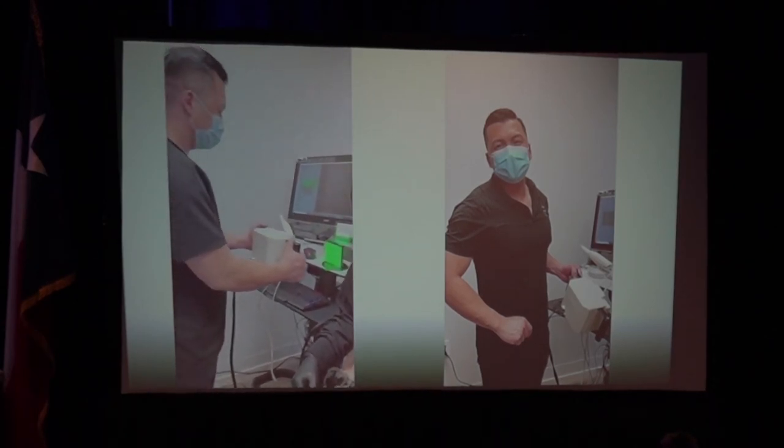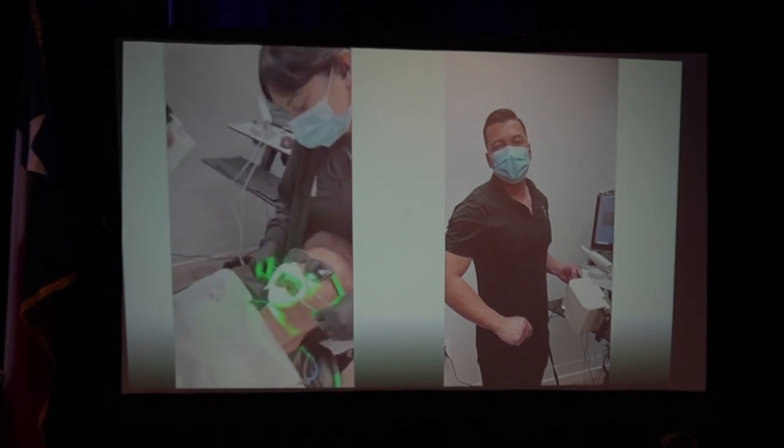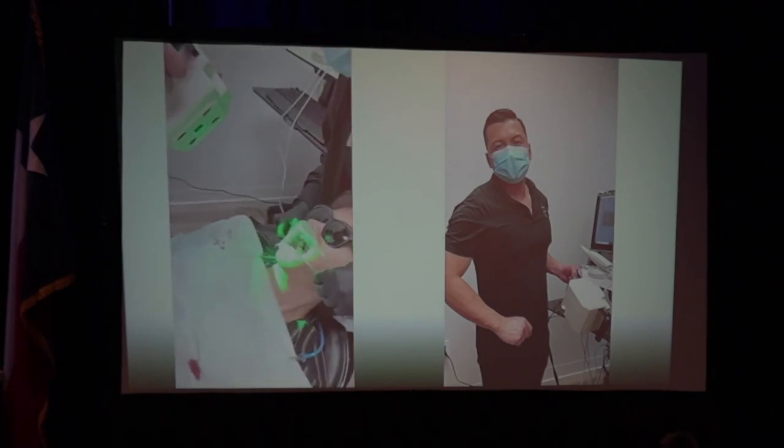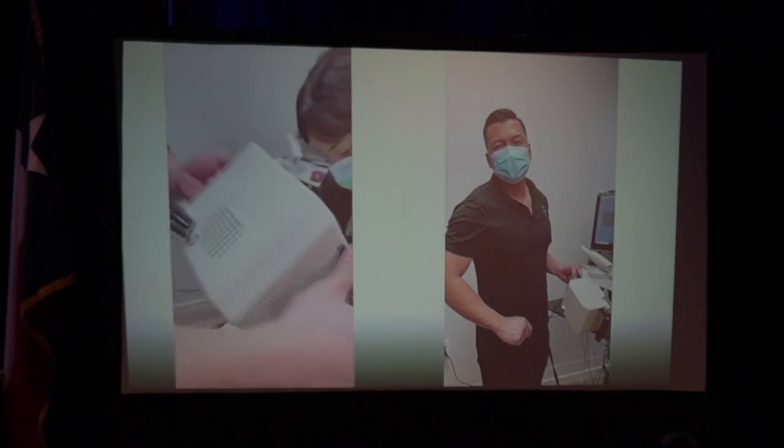So this is the calibration. The argument PIC gives is like, oh, well, we don't want to calibrate. It took 5 seconds. And now you're giving more accuracy to your scanner because in your environment, it's calibrating the scanner right then and there.